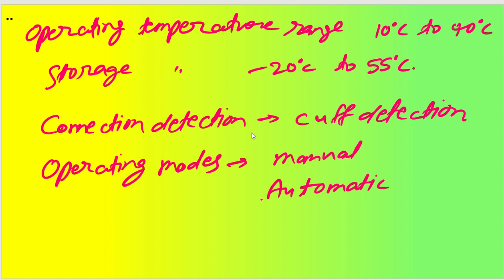Now connection detection: we will have cuff detection, like once the cuff is connected, we will show on the device that yes, the cuff is connected. We will have operating mode, as I told you, it will be semi manual, like manual mode as well as automatic mode, right?